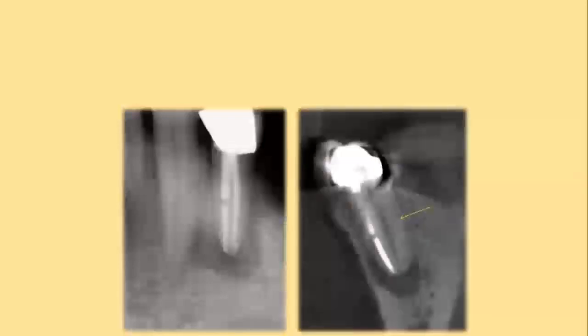That's endodontic treatment, diffuse radiolucency at the apex, probably a periapical scar maybe. But then CBCT will tell you, hey, there's another root that you did not see on IOPA. So that was not obturated because nobody knew it was existing. Okay, so suddenly a diagnosis would change from just a scar to saying, hey, no, it's an abscess, redo again. So that's a supernumerary root tooth.